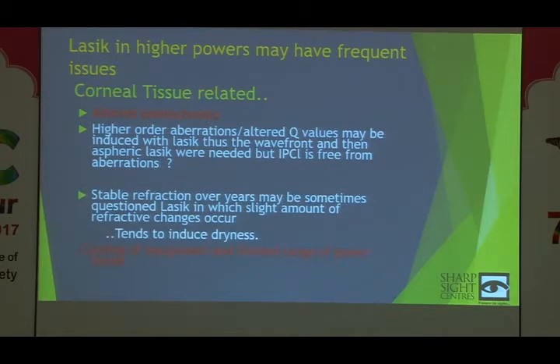I've been through those times when there was a cutoff of 250 microns. And then one of our fellow colleagues made the headlines of a newspaper, I'm sure sir would remember, saying, Indian eye is not fit for LASIK. And boom, in 8 months we just did, I think, 40 LASIKs. We were finished. So LASIK has gone through ups and downs, and I guess new things will keep coming up. They'll keep shining out. What we need to do is find a stable system and have a customized flow chart. For this patient, I can do that; for this, I can do that. But there'll be some common overlap areas where the surgeon can decide according to his choice.